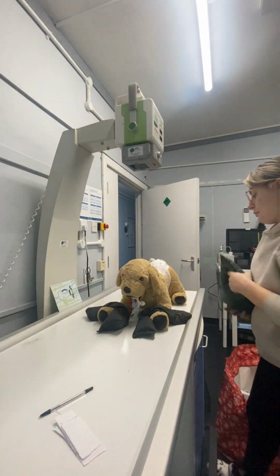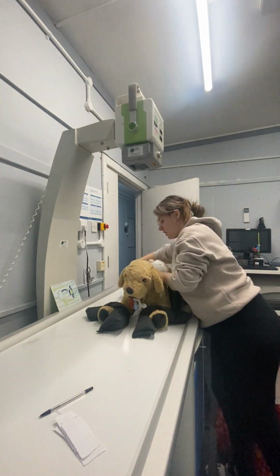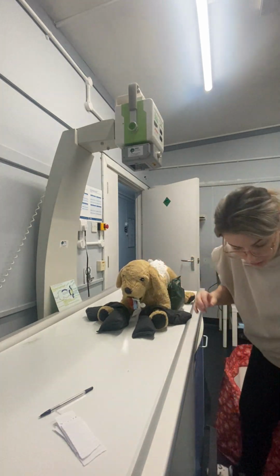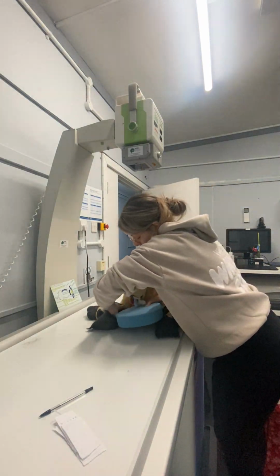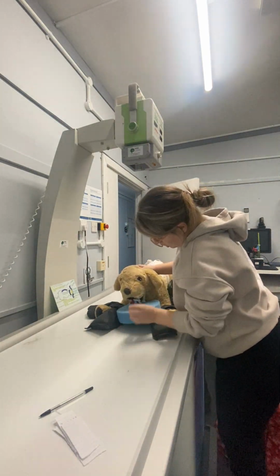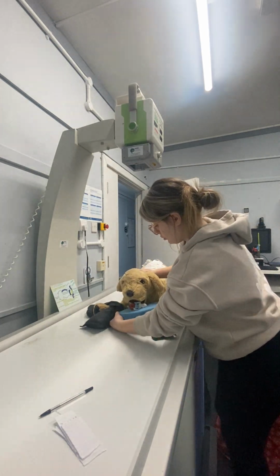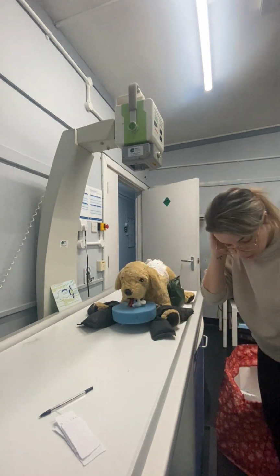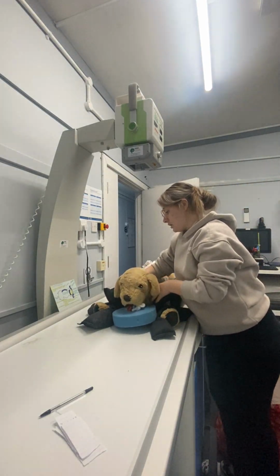I'm going to use a sandbag just down the side of his body, just so that he's straight. I'm going to use a foam wedge just underneath the chin, just so that he's nice and straight. And then I'm going to use another sandbag just over the neck as well.